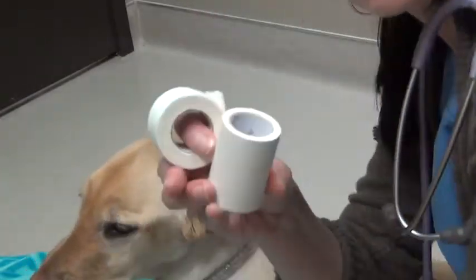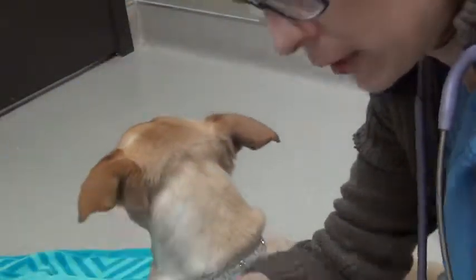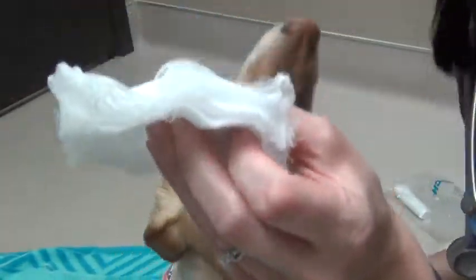The supplies I'm using are porous tape, 1 inch and 2 inch. I've got roll gauze, that's 4 inch. I've got a Telfa pad just in case we need it for a wet wound on the ear. And I have vet wrap, and I've got some gauze sponges to use under the ear.